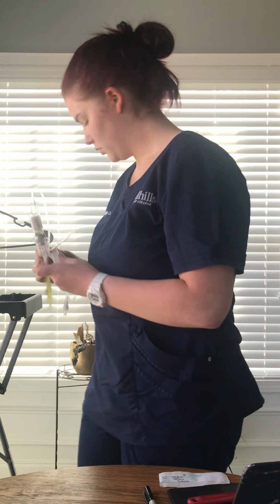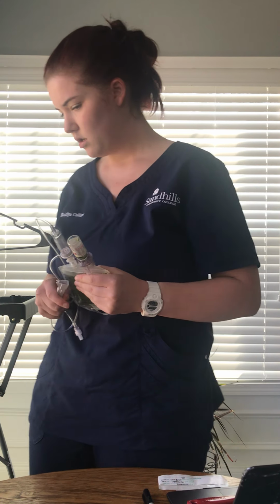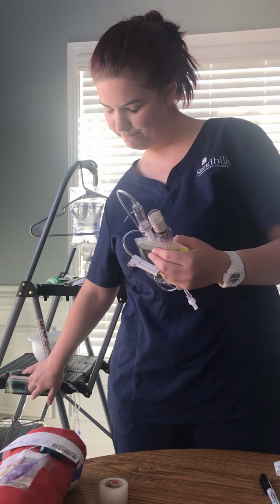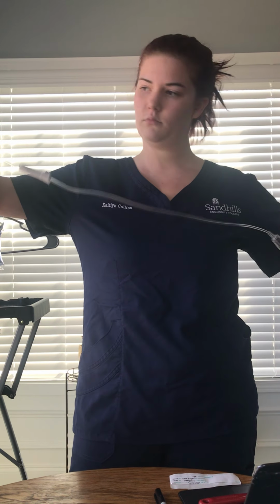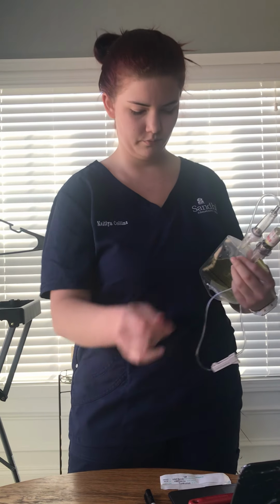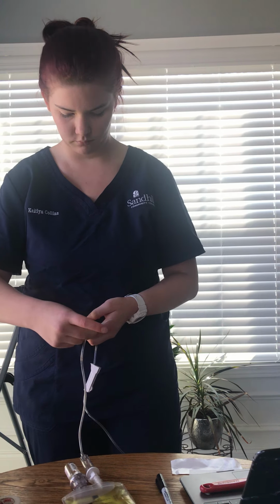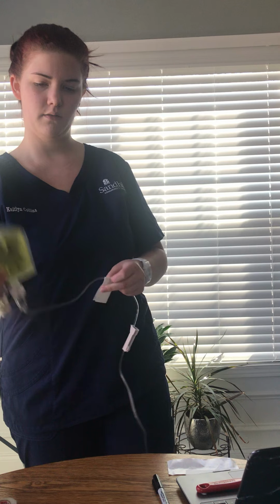All right. Now I'm going to check my IV site and find the Y port above the pump. My tube needs a label, so I already created one, and I'm going to put it on here. All right, I've labeled it.